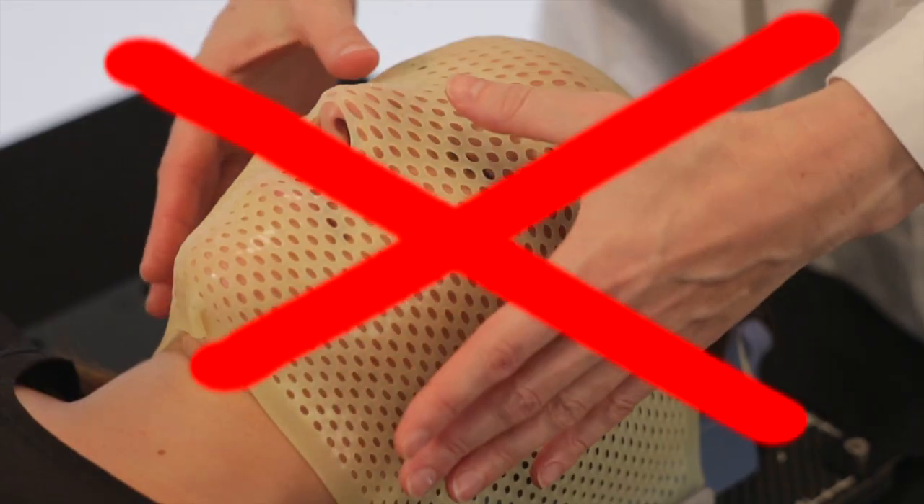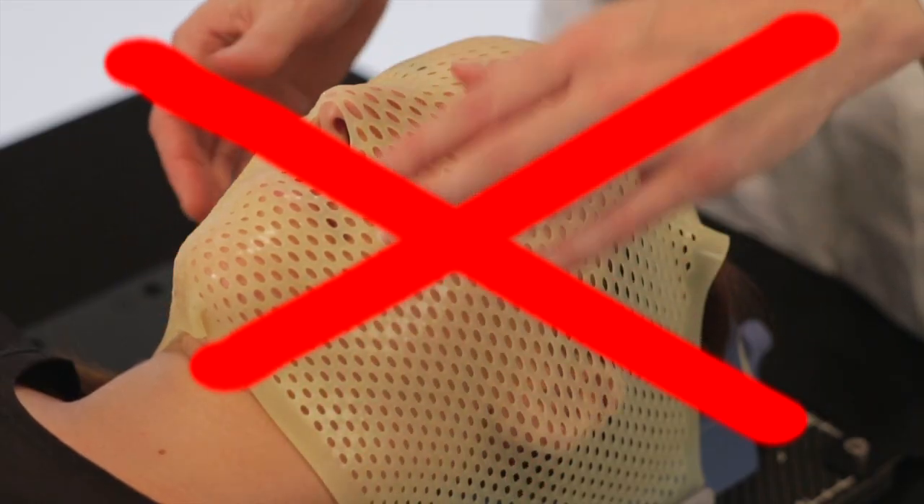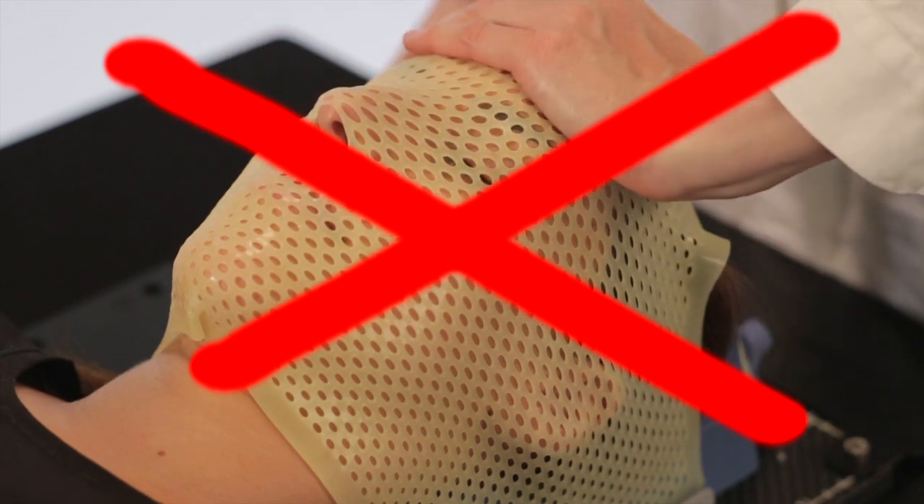Do not press the eyes of the patient. Do not mold over the forehead and the cheeks to prevent a mask that is too tight.